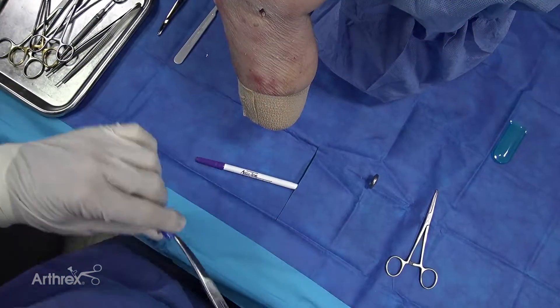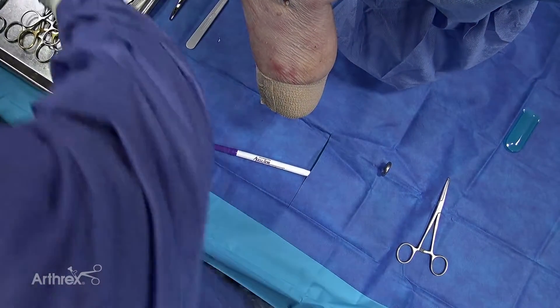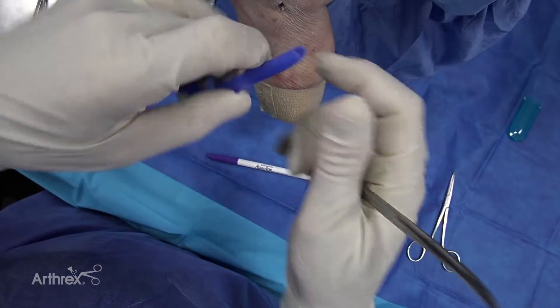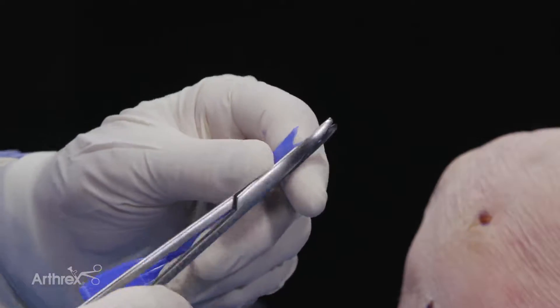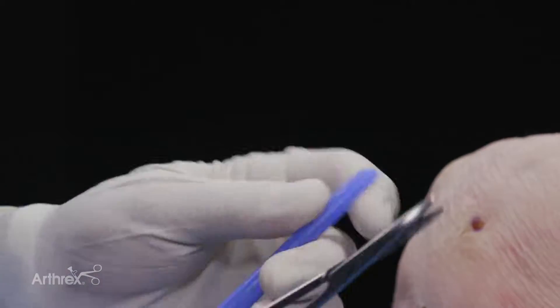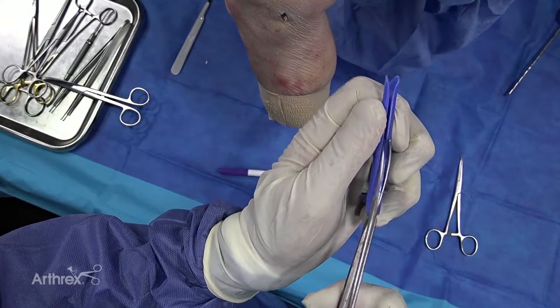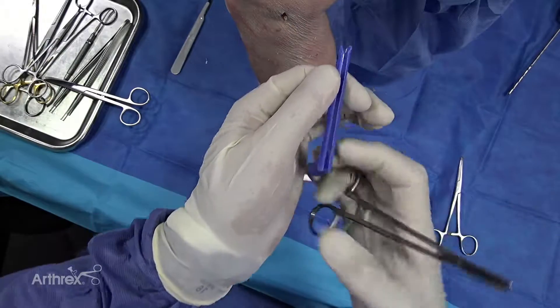Now the next thing we're going to do is we're going to modify this shoehorn cannula. The first thing you need to do is you need to make it so it doesn't move, so you can do this percutaneously and not lose your sights. You make a little nick in the back, and then you trim the sides into two little points. And then you have to run down the middle of this and widen the slot, because it helps to pass the fiber tape distally to have that run right down the middle.